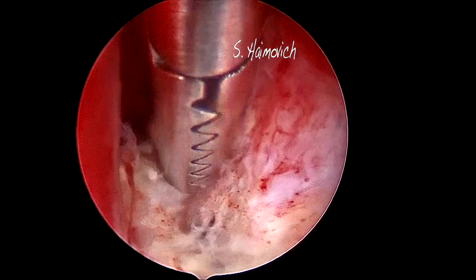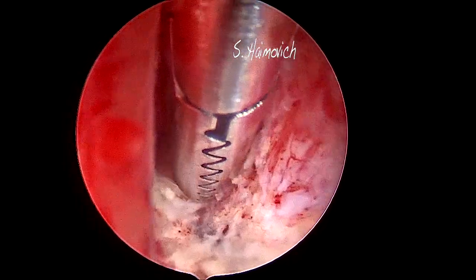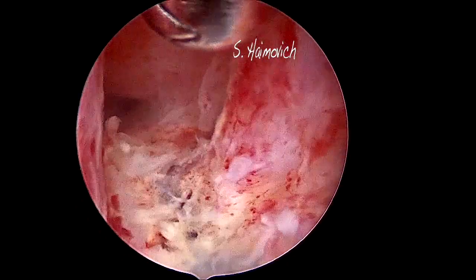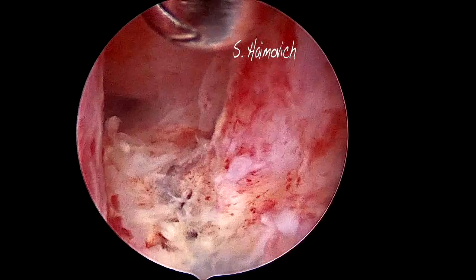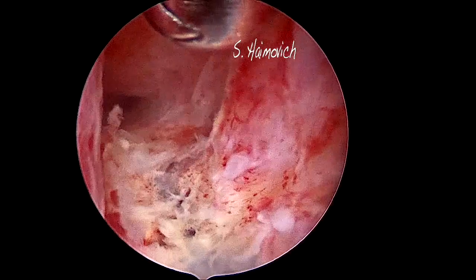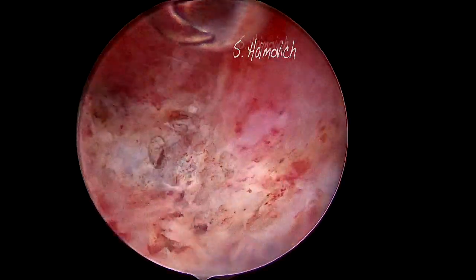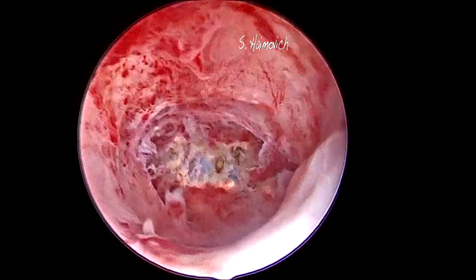With the help of a grasper we gently looked for the right tubal ostium, and finally we found it. This is the first step of our surgical procedure. At the end, hyaluronic acid gel was left in the cavity.